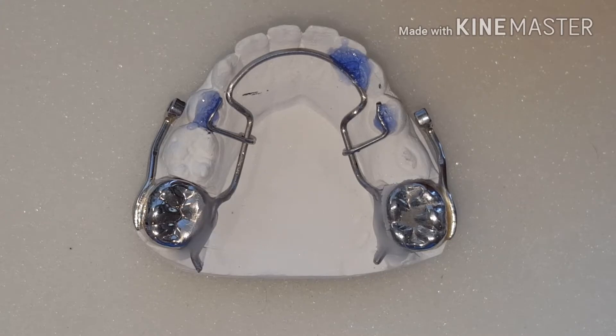Hi, this is Steve Zahra from Zahra Dental Lab. In this video there will be a short overview on how to protect your solder joints from being overheated with heat shield.